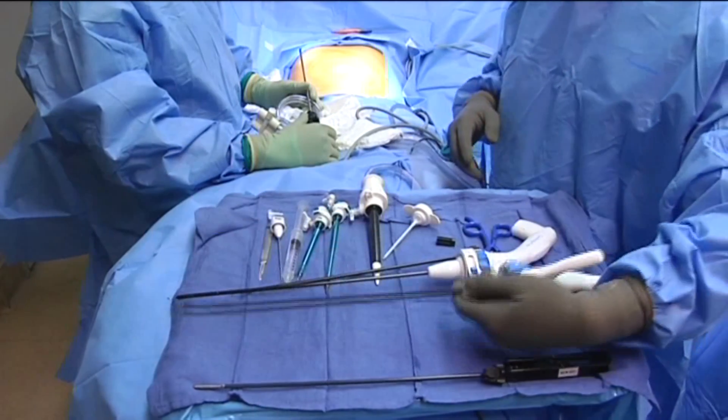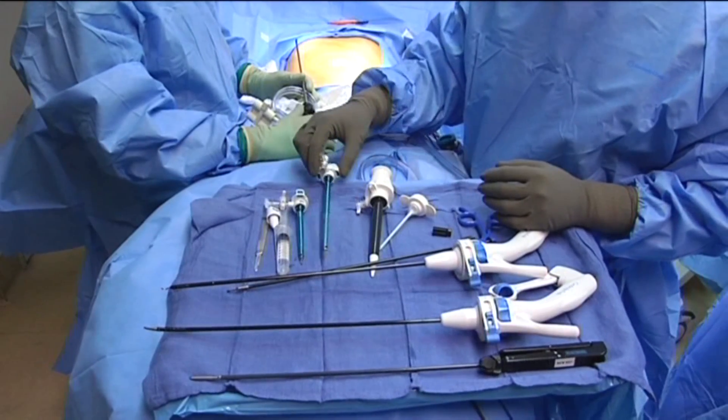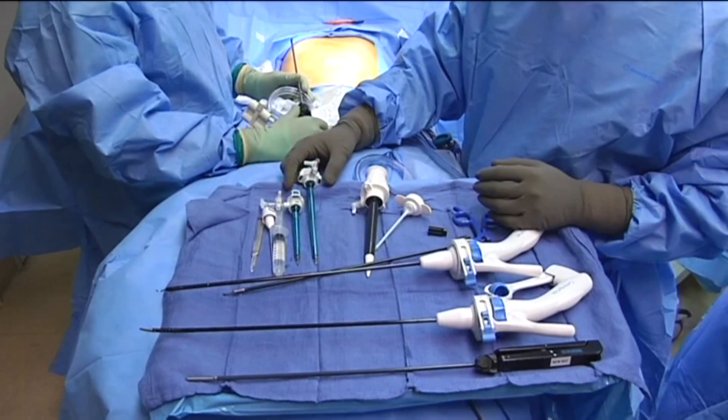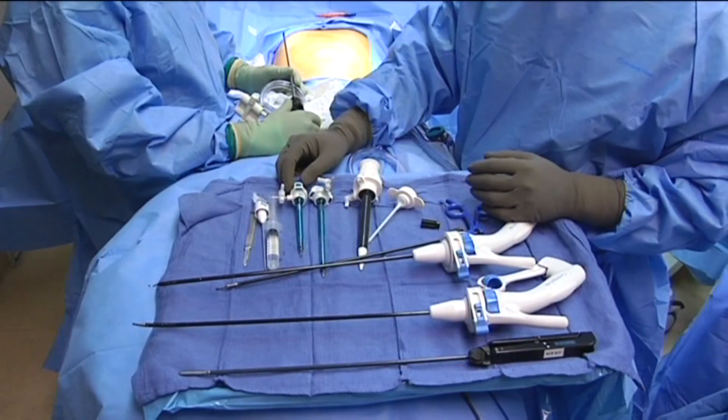In addition, we'll be utilizing small-profile laparoscopic trocars. As you can see here, there's two different sizes — a long one and a short one — and this is really the key to not fighting the heads of the ports. All right, why don't we get going?